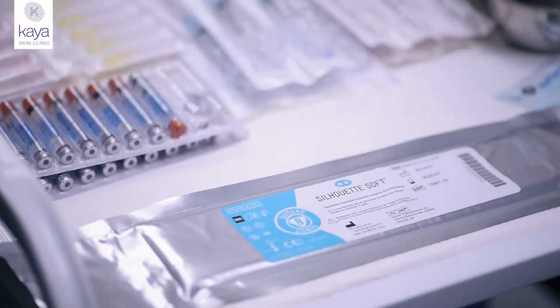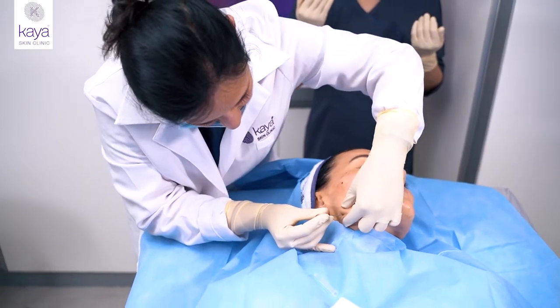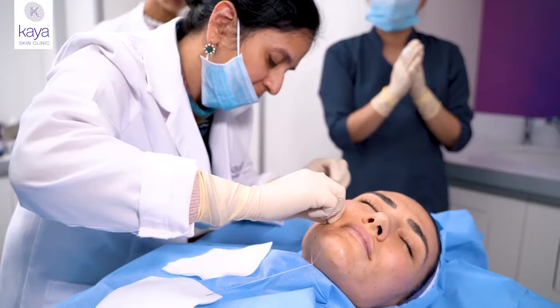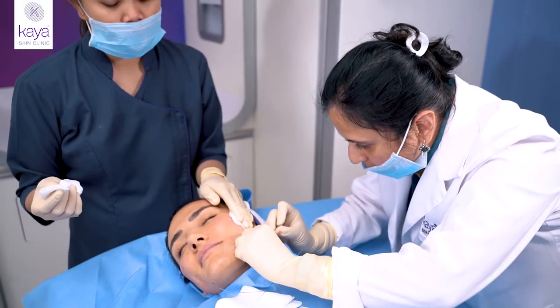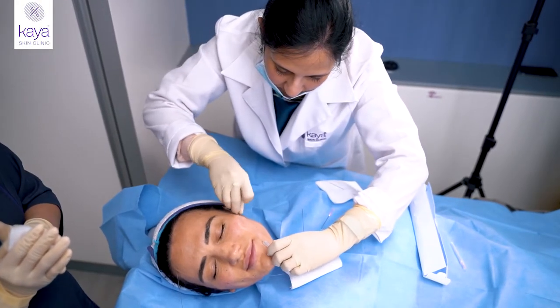Today we're doing threads. These threads are suture materials that are used to lift the soft tissues, and these threads will help lift the areas of the face that are slowly sagging. It causes an immediate tightening effect and then slowly builds collagen over the next couple of months to improve the results even further.